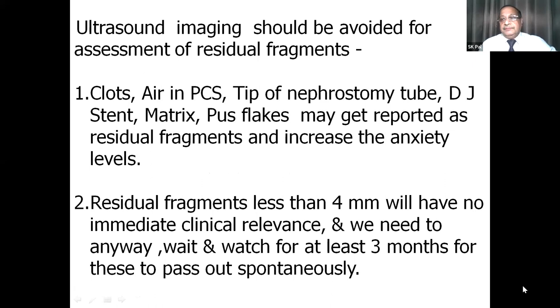Ultrasound imaging should be avoided, particularly for residual fragments, because the clots, air in the pelvicalyceal system, tip of the nephrostomy tube, double J stents, matrix, pus flakes, everything will be echogenic, and it may get reported as residual fragments, and it will increase the anxiety of both the patient as well as the surgeon. So residual fragments less than 4 millimeter anyway, you will not be doing a redo PCNL. You will have to wait and watch. So by ultrasound, you are not going to gain anything. Then you will not make any immediate clinical decision, and you will be waiting for 3 months. As we do in RIRS, we wait for 3 months before all the fragments are passed out.